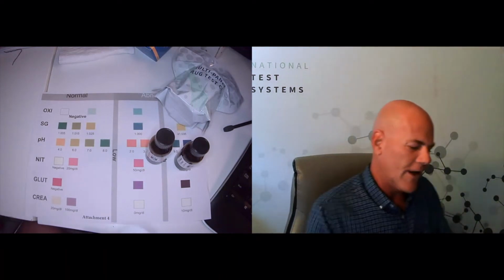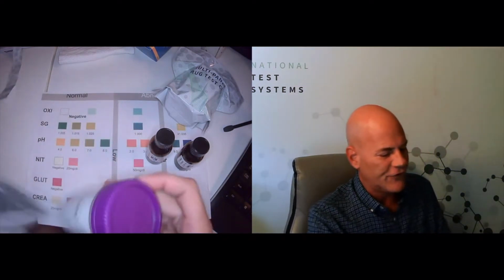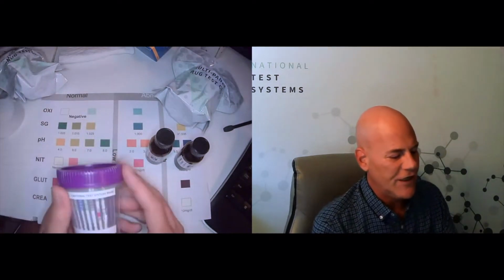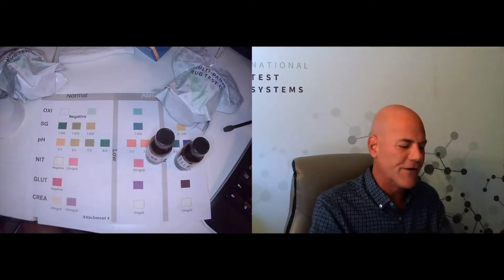All right, so let's go ahead and use the first one. We're going to open up one of our cups. If you guys have been with us a while, you should recognize our now world-famous purple lids. I'm going to peel off the privacy panel. I need to cheat and remember what order these adulterants are in. Oh, yeah, I'll be needing my glasses here in a second.